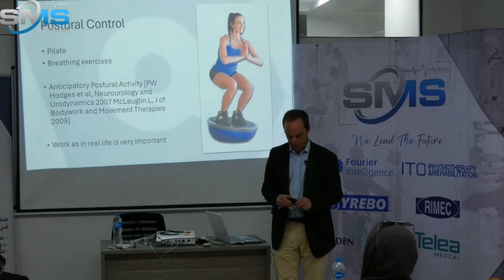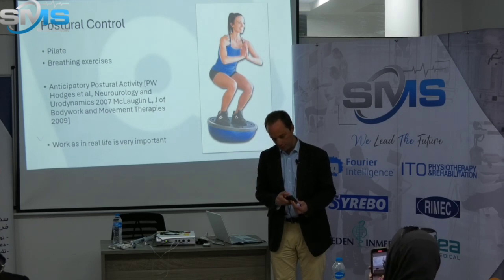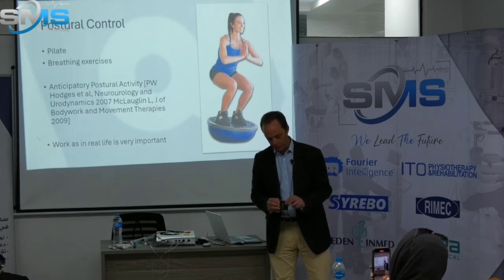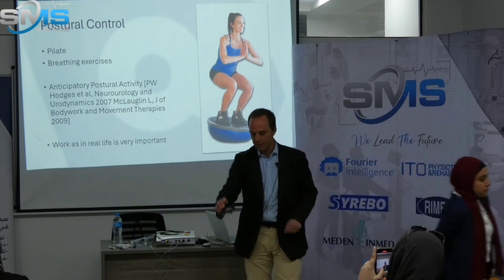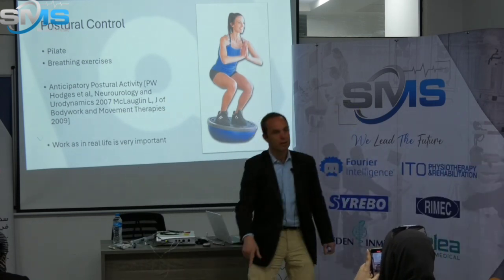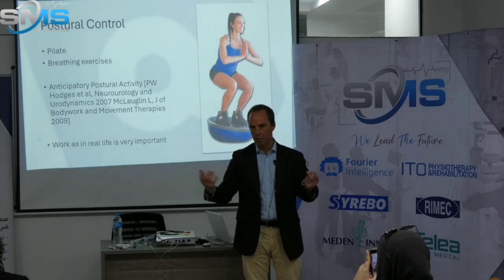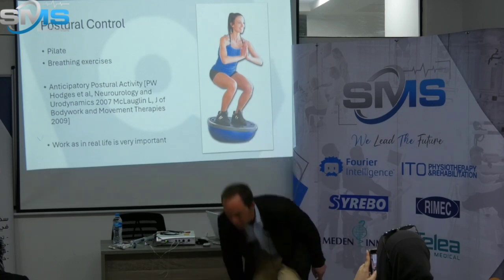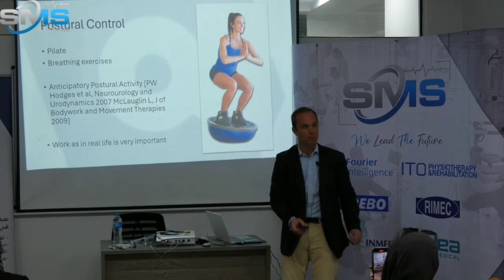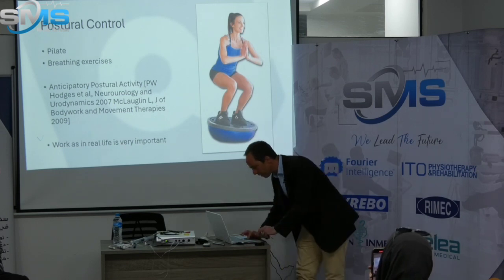This requires, sorry, I don't have all the devices I would like to have today, but this requires this kind of device. So you see, just a small device that I will stick on my balance board, let's say a Bosu or whatever plate you can use for working with movement. So my patient is on my balance board, this device also, and with this, I can track the movement of my patient.